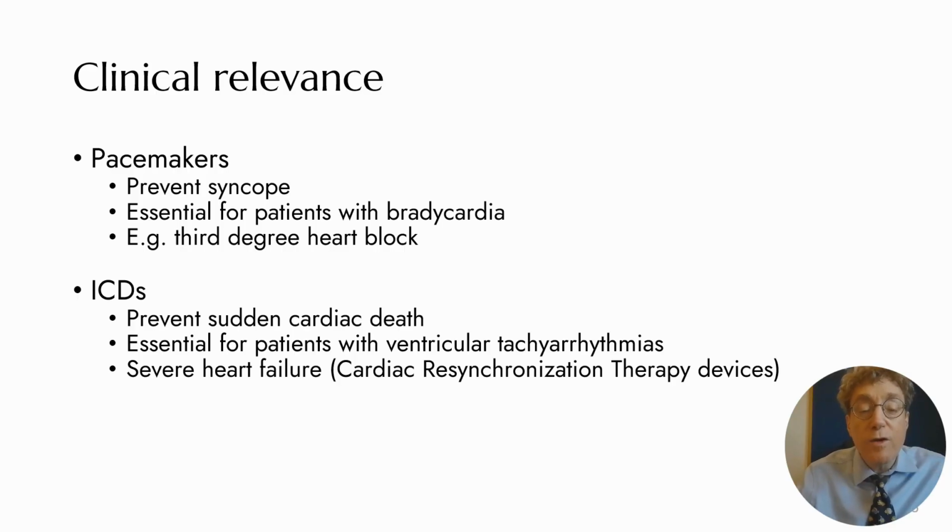This is very different from ICDs or defibrillators. Defibrillators are devices to deal with known risks that are meant to prevent sudden cardiac death. That is when the heart becomes suddenly very disorganized electrically, such that it can no longer pump. And instead of having minimal or too little activity, often during sudden cardiac death, patients have too much electrical activity, but it's disorganized.